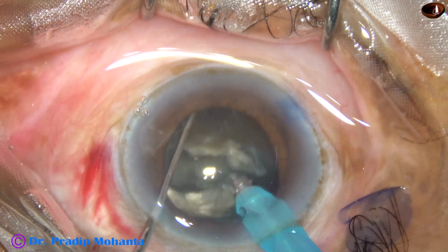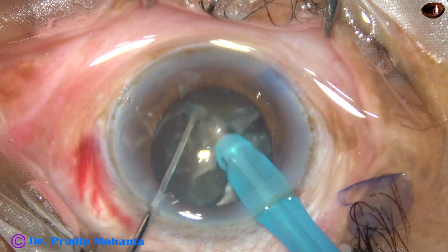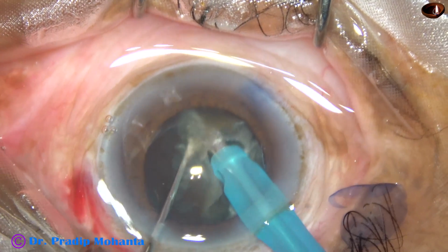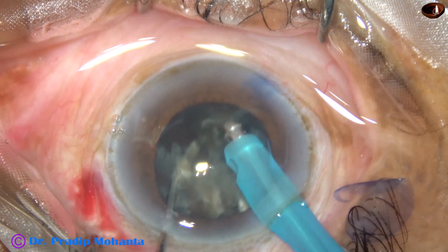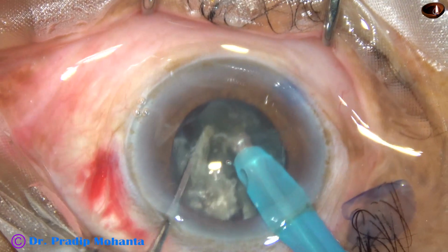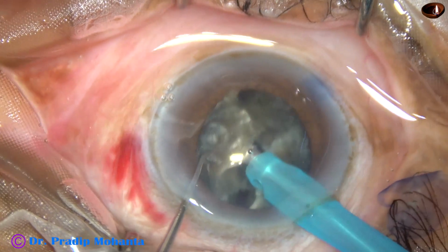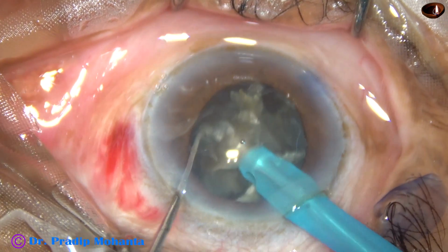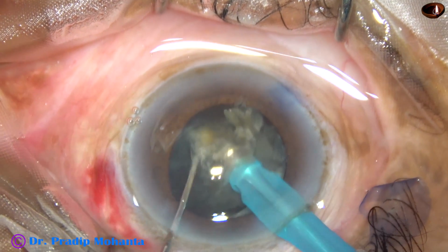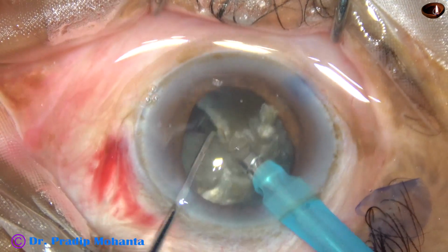After rotating 180 degrees, the heminuclei are separated completely. And now each heminucleus is being separated into 3 fragments by 2 chops. This is first chop and this is second chop. This principle is same. Deliver the ultrasonic energy into the substance of the nucleus and thus there is no ultrasonic damage to the cornea.